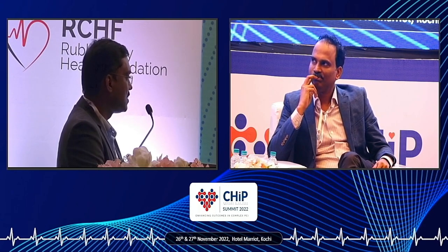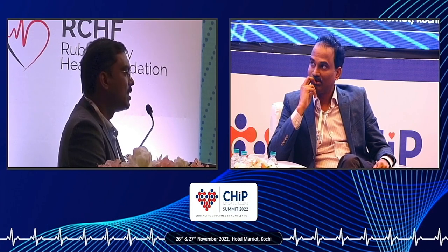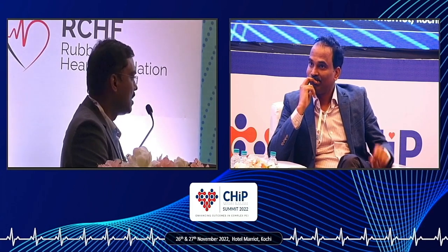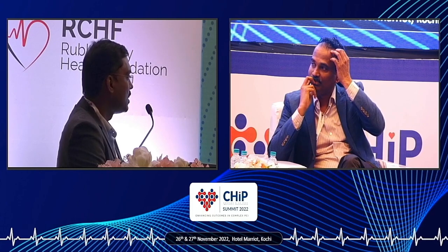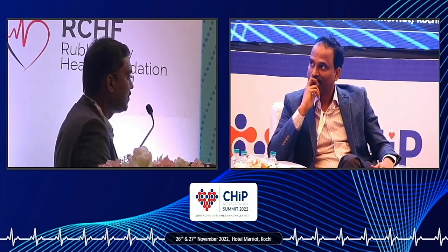I don't have much data except some small trial from China which has shown that DCB in the LCX ostium the first time itself can give some good results. But that's what I will be doing. As you rightly said, not only for left main restenosis, for any kind of restenosis, this is an adjunctive tool. The only mechanism they are telling is that it ablates all the restenotic tissue. So we will get a good plaque volume reduction, but in the long term, we don't know. Long-term data is not much available, especially for diffuse ISR, no long-term data available.